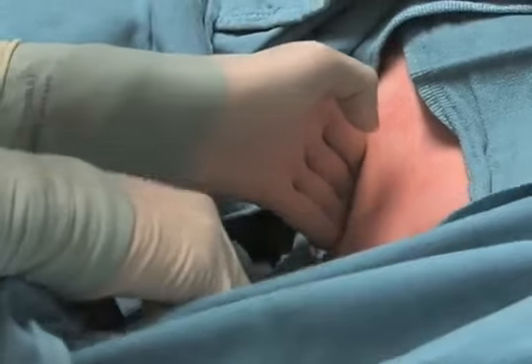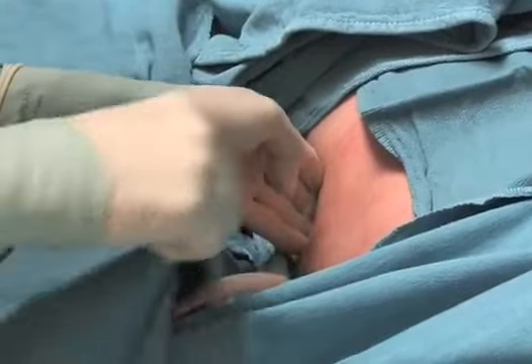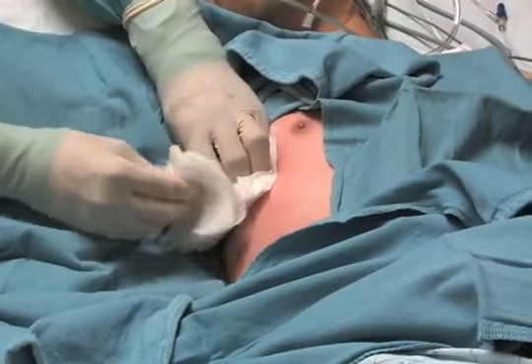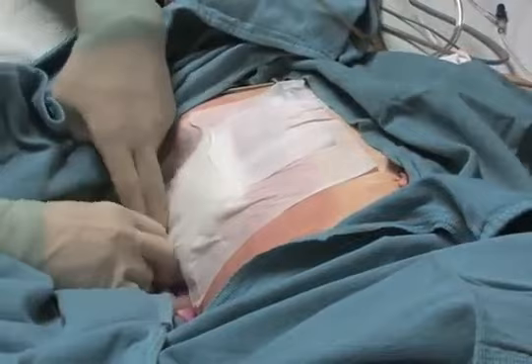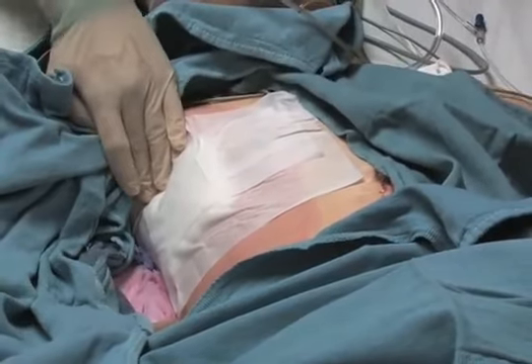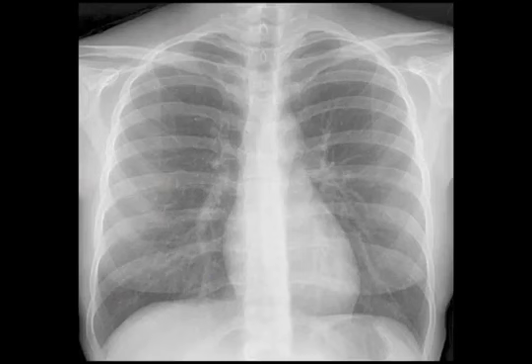Once the tube is removed, quickly seal the incision site with a petroleum-based gauze, reinforced with several pieces of regular gauze on top of it. Secure the site with a pressure dressing. Additional sutures may be required to close the incision. A follow-up chest X-ray should be obtained 12 to 24 hours after the tube has been removed. Closely inspect for any suggestion of a new pneumothorax.